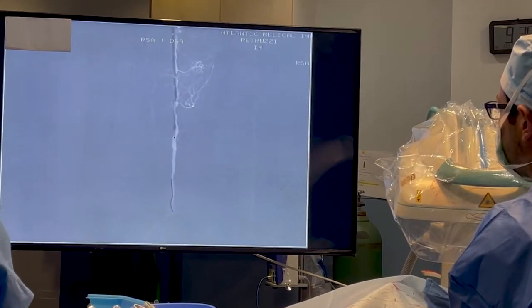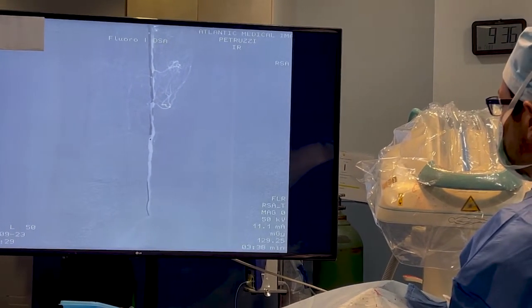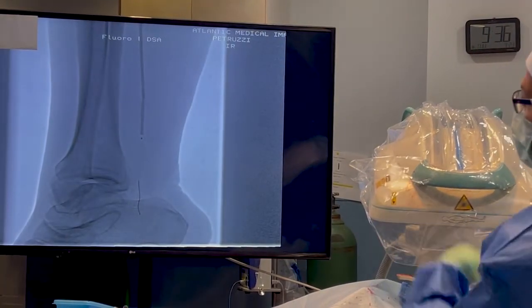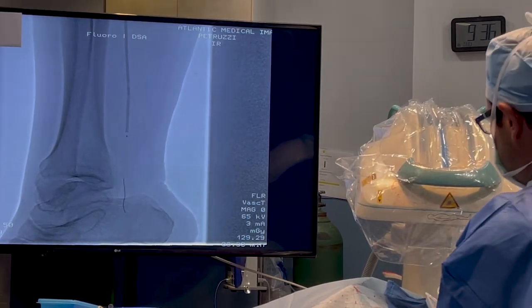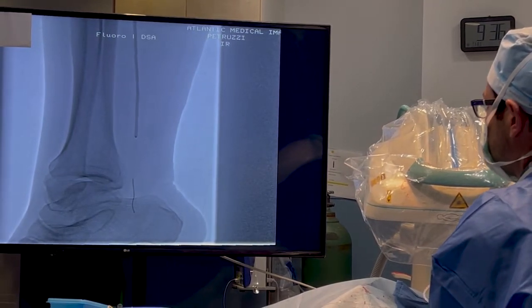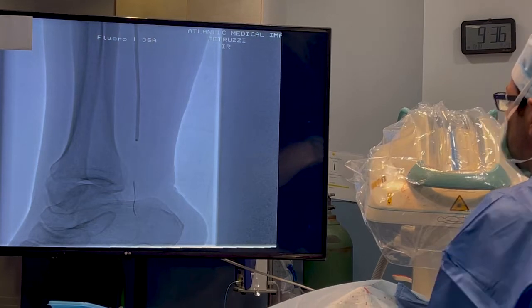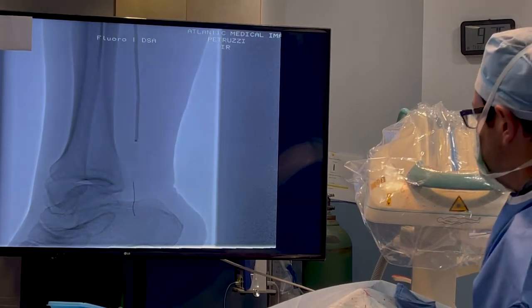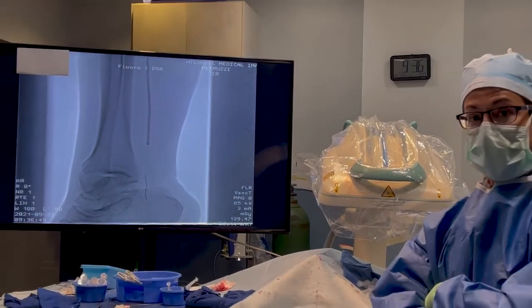If you see the dark area behind it, and I'm going to remove this white background picture, and you'll see the balloon. And can you see the little narrowing in the balloon on the waist? That's where it's narrowed, and there's plaque. And as we inflate the balloon, you're going to see the waist go away. Just like that. We let that sit for a minute to do its work, and that's going to help open up those blockages now that we've cleaned out the plaque.